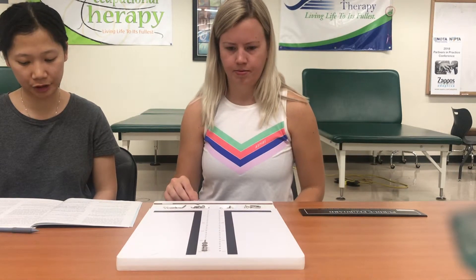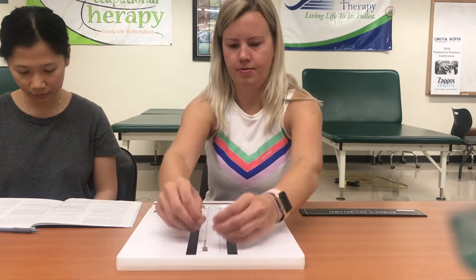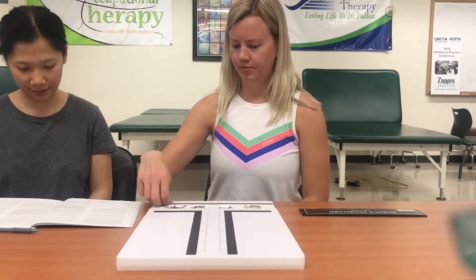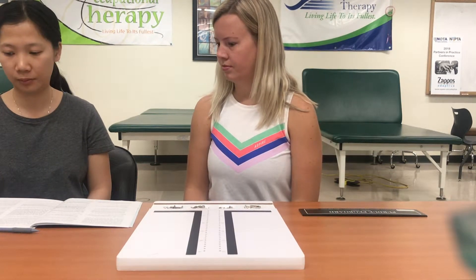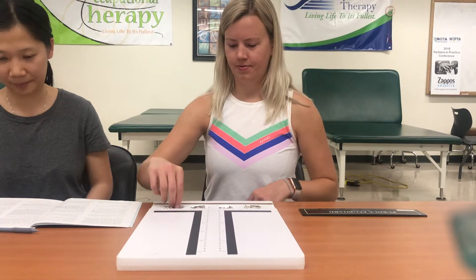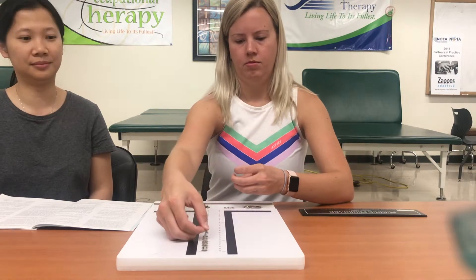Stop. Return the pins, collars, and washers to the proper cups. When I say begin, make as many assemblies as you can, beginning with the top right-hand hole, work as rapidly as you can until I say stop. Are you ready? Begin. Stop. The examiner counts the completed assemblies: one, two, three, four, five.